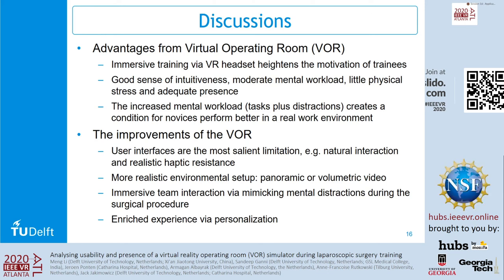From the results of this study, we learned the advantages and improvements of the VOR. The immersive training via VR headset heightens the motivation of the trainees. The VR surgical training demonstrated a good sense of usability and presence. The increased mental workload creates a beneficial condition for novices to perform better in a real-world environment.